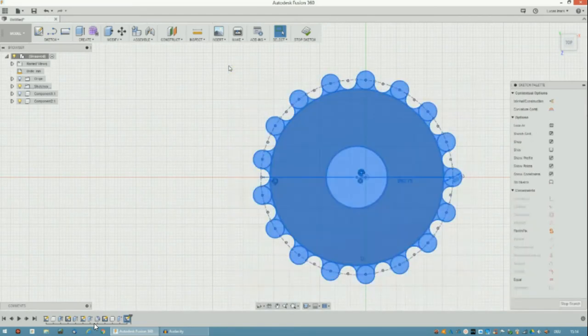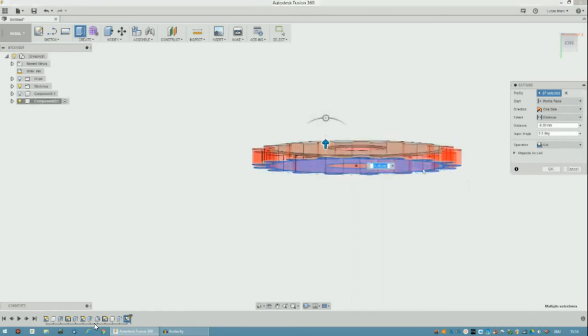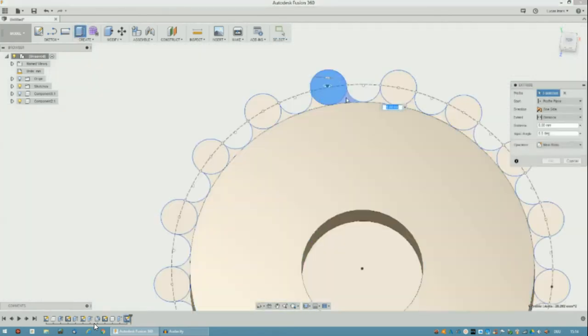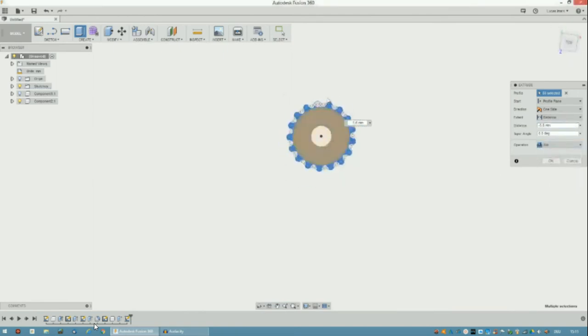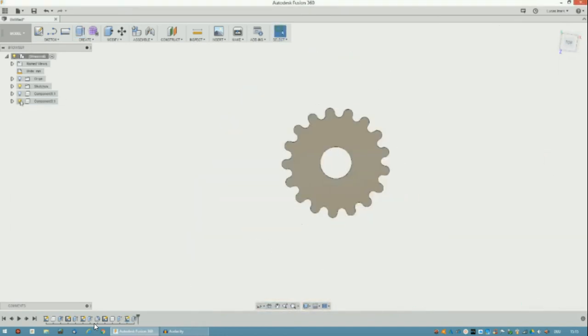Now I choose everything and I unchoose the center. Here I forgot it. And yeah, it closed the hole. So now I choose everything and unchoose the center. Don't forget this little part, and here we go.